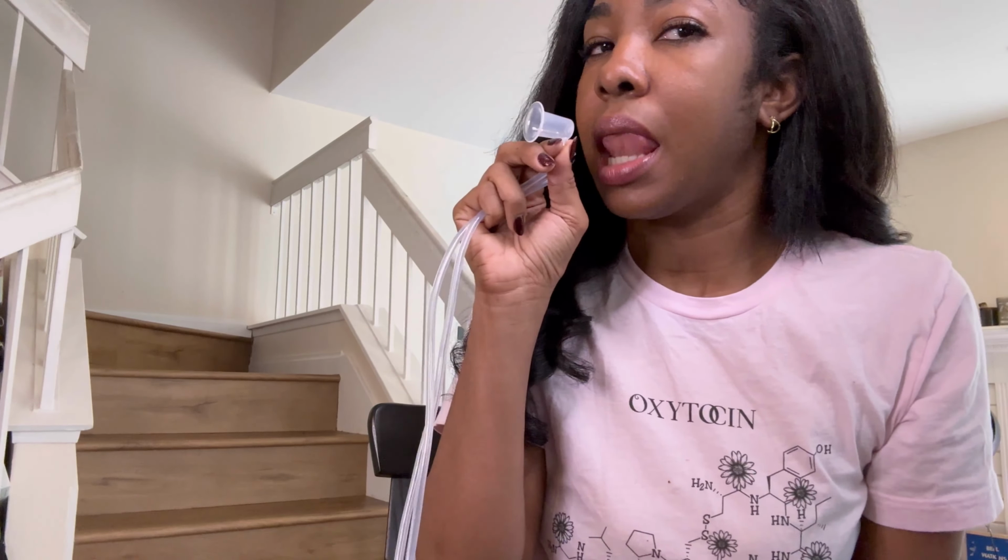But for the device itself, all you need to do is clean these little collection cups or these little nipple cups. You want to just clean these with soap and water, sterilize them in hot water, and then let them air dry, like on a paper towel or something. Leave those to air dry completely, like overnight, and then go back to using them the next day. These should not be wet when you apply them.